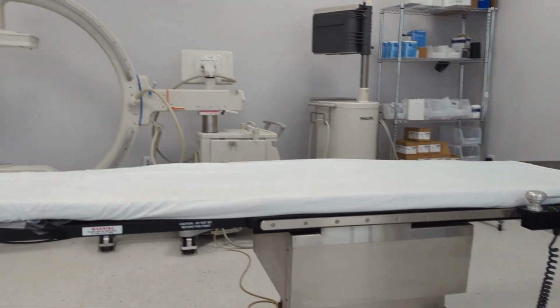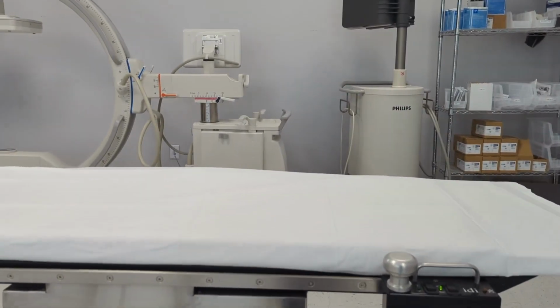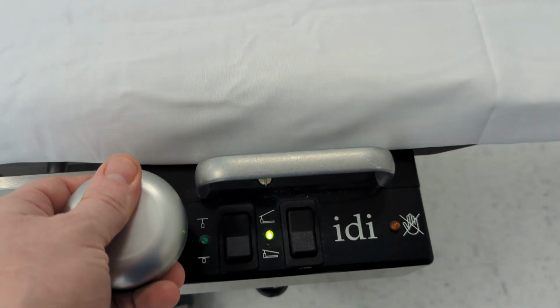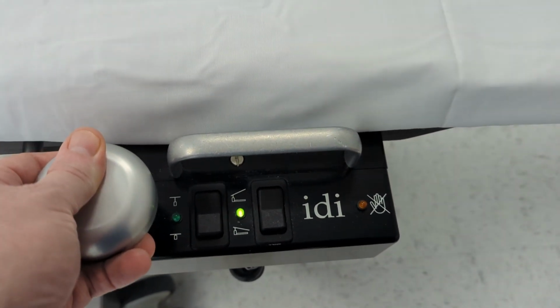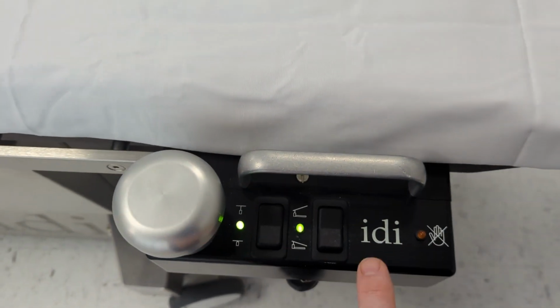We'll bring the patient in and get them ready, and once we get them onto the bed, I detent the procedure table so that the patient is in the middle. This allows the table to pan to both sides without having to adjust the C-arm in the case, and the two green lights show me that the table is centered.